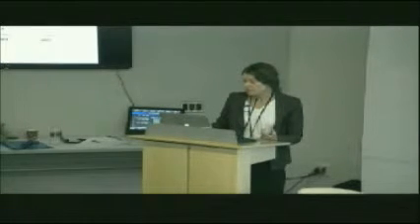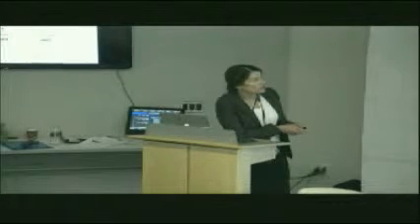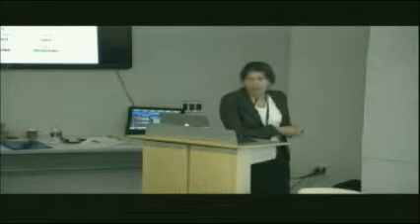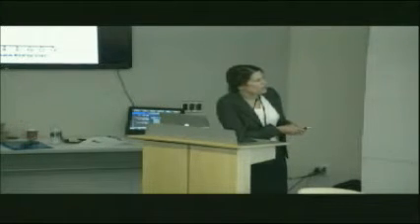And this is important because this is inhibitory here. It's called short intracortical inhibition. This is facilitatory, which is making it more excitable. That's called short intracortical facilitation. And that's important because that relates to neurotransmitters in the brain and spinal cord. GABA is the main inhibitory neurotransmitter in our brain, and glutamate is the main excitatory. And we know that changing this interval changes how the MEP responds.